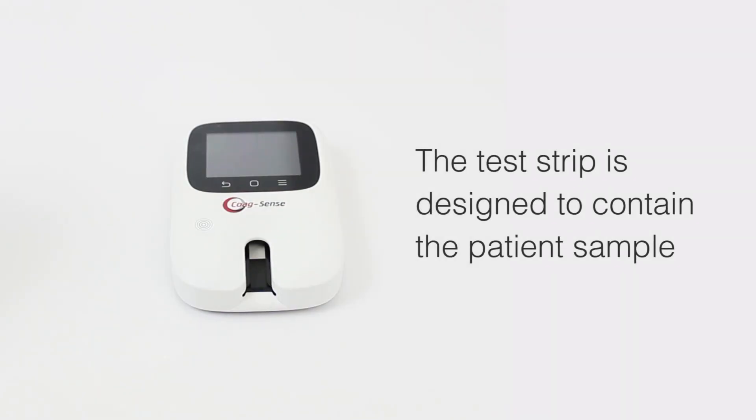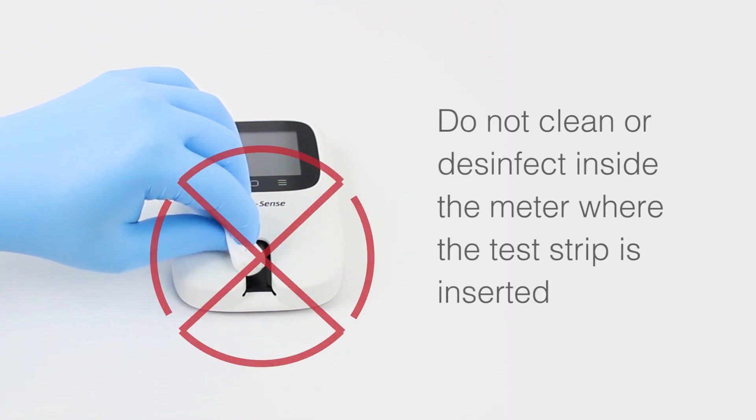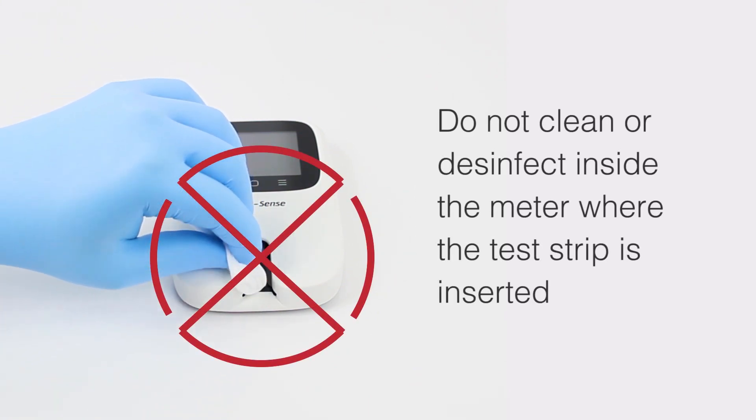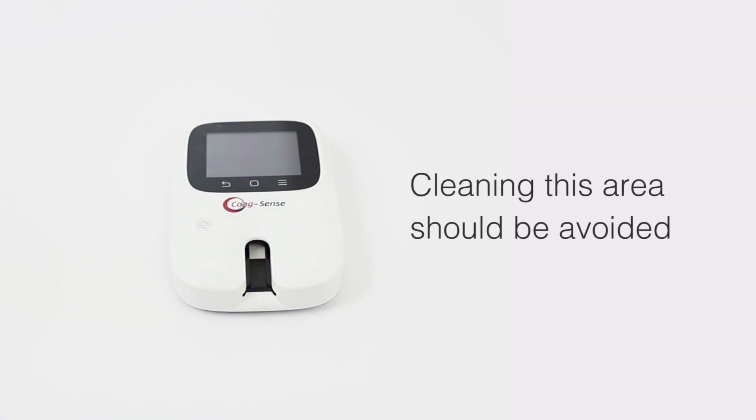The test strip is designed to contain the patient's sample, preventing it from entering the meter. Do not clean or disinfect inside the meter where the test strip is inserted. Cleaning this area should be avoided.